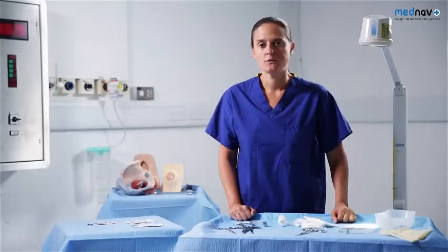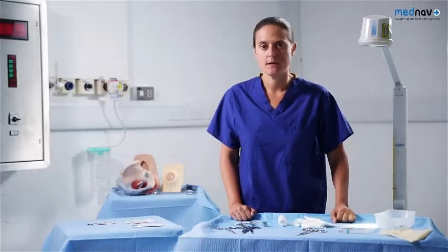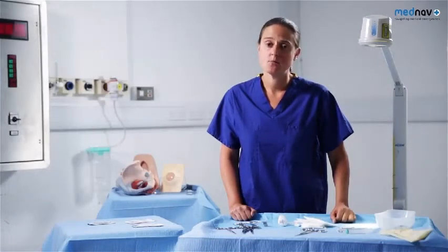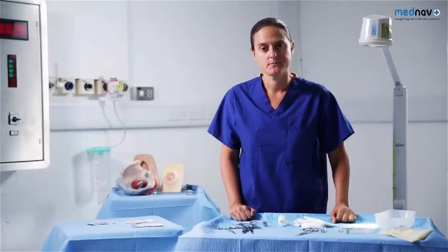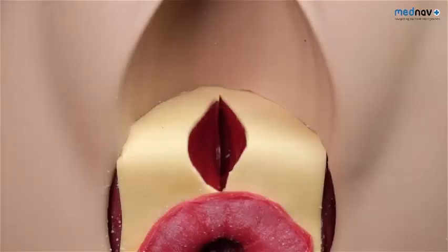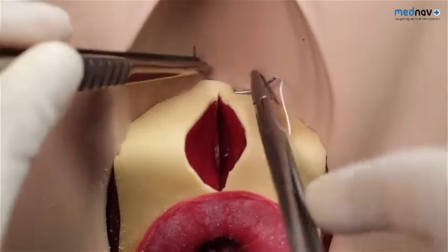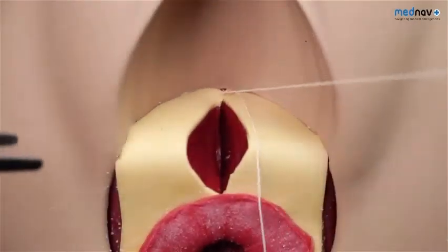The aim of perineal repair is to restore normal anatomy and achieve haemostasis. All dead space must be closed to reduce the chance of haematoma formation. You must take care not to use any undue tension, as this can result in chronic pain. You will need to perform a PV and PR examination to ensure there have been no buttonhole tears and to identify the extent of the injury. You should change gloves between examinations. First degree tears may heal spontaneously but will need to be sutured if they are bleeding. For second degree tears, clean the area to clearly identify the perineal anatomy and infiltrate with local anaesthetic. Identify the apex of the tear.